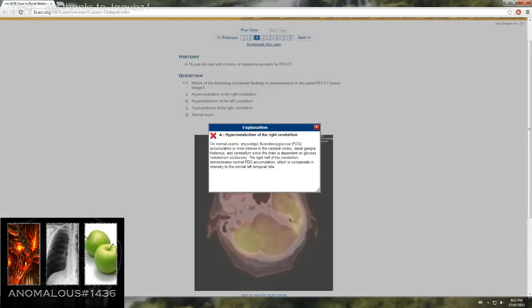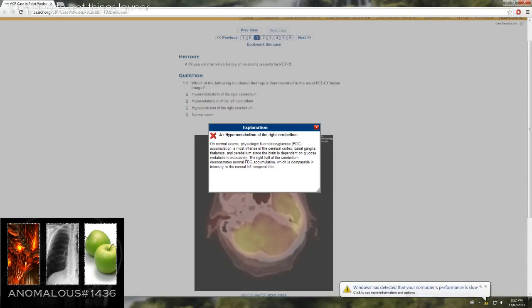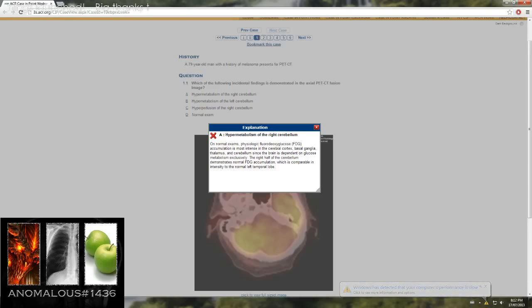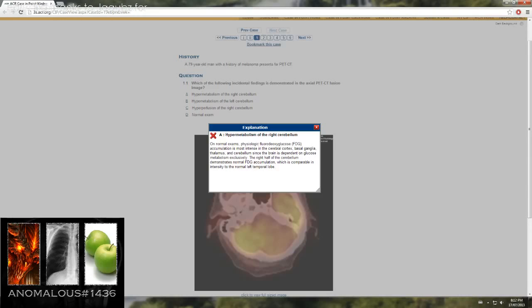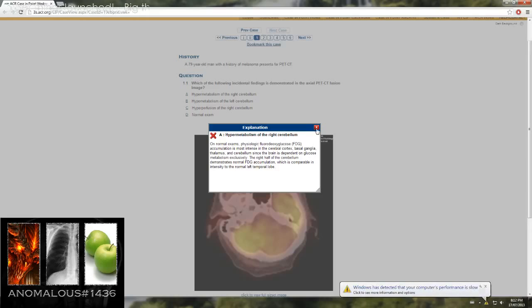A normal exam physiologic. FDG accumulation is most intense in the cerebral cortex, basal ganglion, thalamus, and cerebellum, since the brain is dependent on glucose metabolism exclusively. The right half of the cerebellum demonstrates normal FDG accumulation, which is comparable in intensity to the normal left temporal lobe.